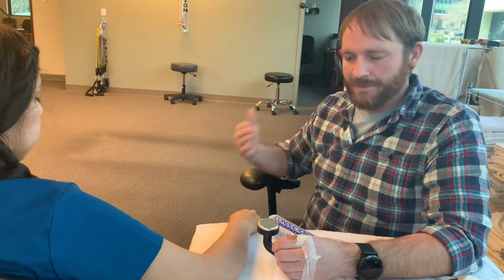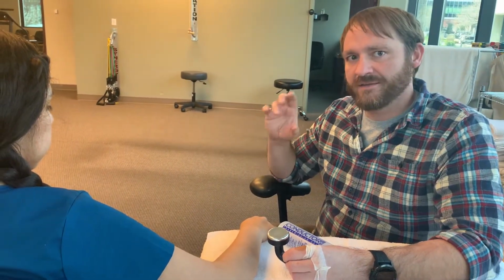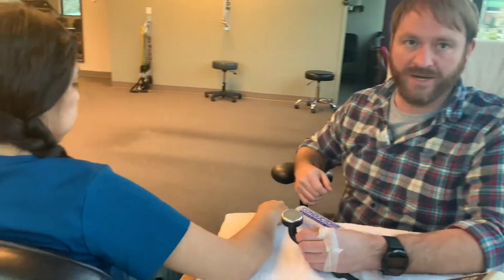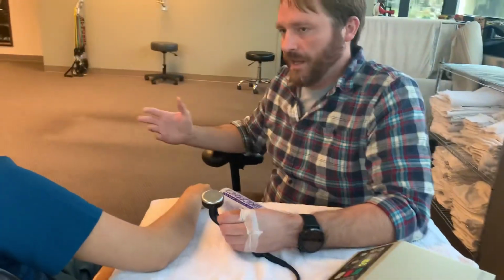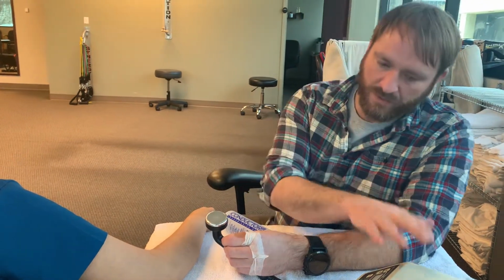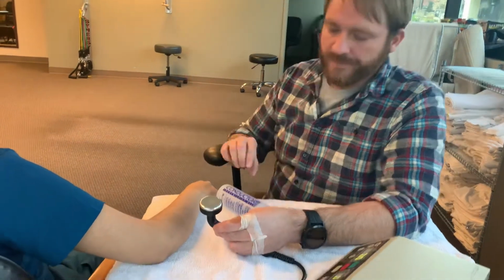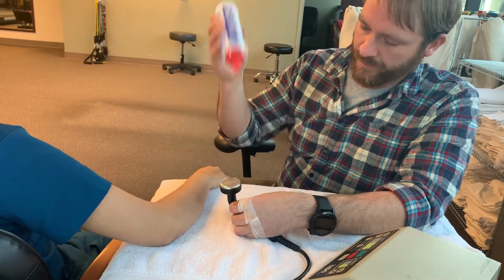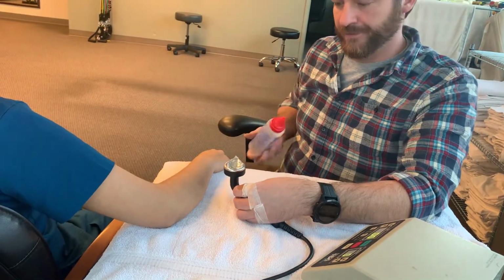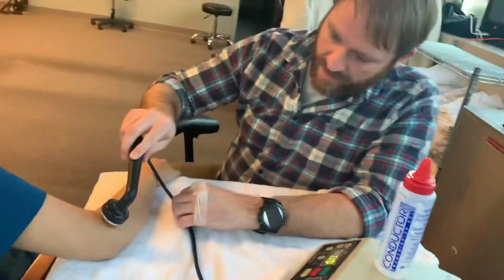If we don't apply a medium, or if you don't have a little bit of pressure on the head, there is a potential for that piezoelectric crystal to rattle off the transducer. It's really just a precaution that most places will tell you when you buy it. Again, haven't heard a lot of research done on that, but that's what we're trying to do. So first off, I like to put it here on the head, mostly because I like to make the little ice cream cone design at the top. Then we're going to place that on the area.